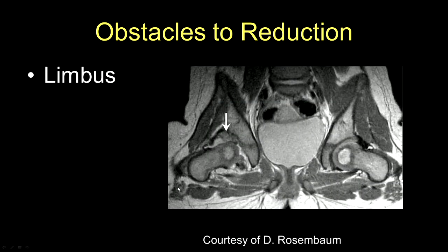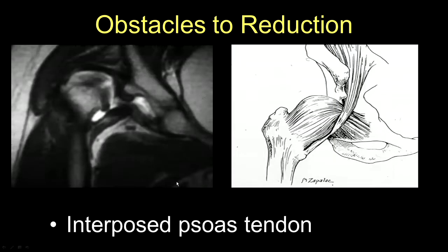Here is the limbus by MRI. And finally, this is the interposed psoas tendon — the psoas tendon interposing itself between the femoral head and the acetabulum. Here is the psoas tendon, here is the empty acetabulum, and here is the femoral head.